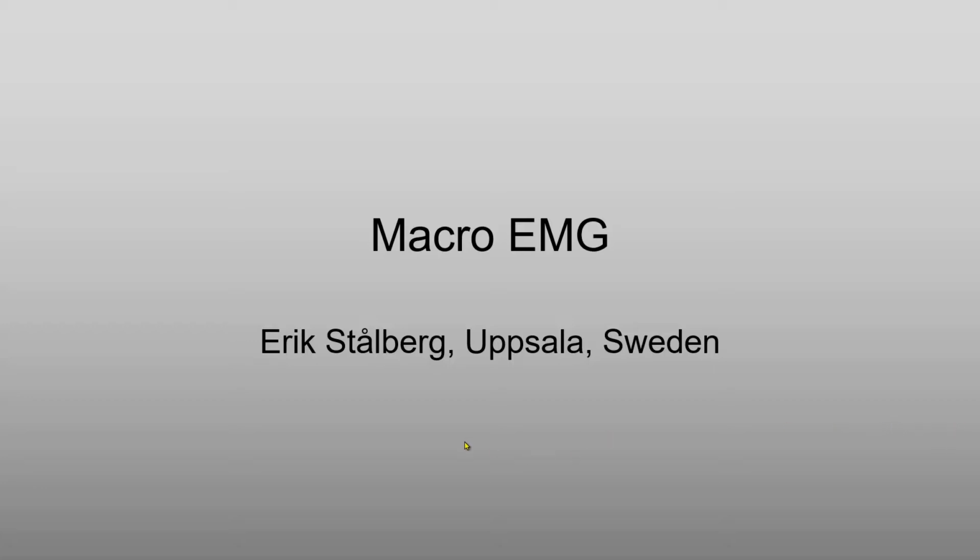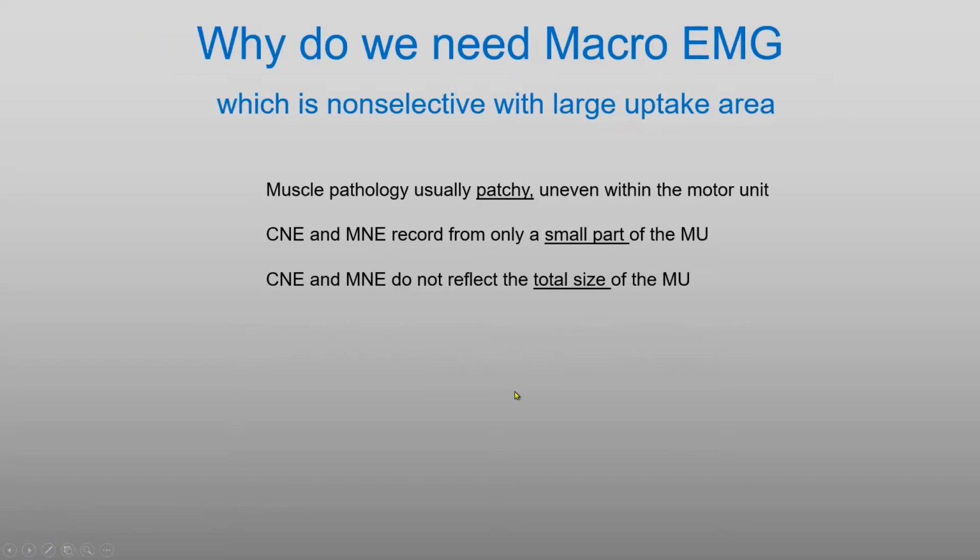Now we are going to talk about the technique called Macro EMG. This was developed in the 80s and has been used in different neuromuscular disorders, but not so much in routine. Why is Macro EMG indicated at all?